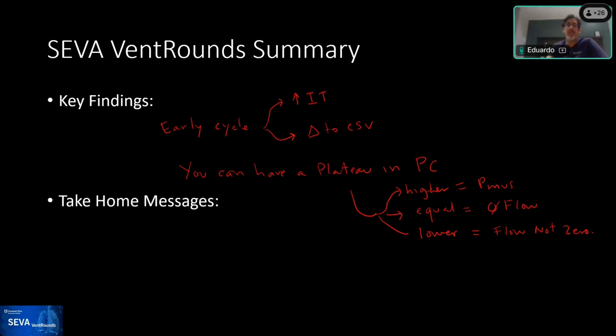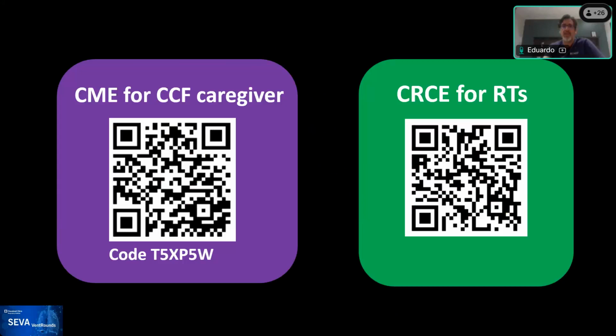All right. With all of that, first of all, Karsten, great job. This was a very challenging waveform, and there's a lot to extract from it, without a doubt. For the sake of time, I think that we did wonders on talking about it.